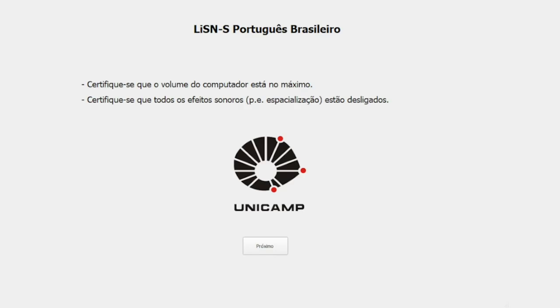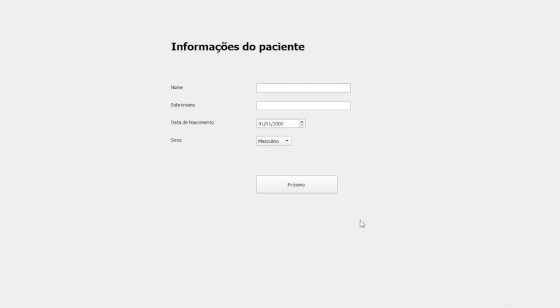Here is an example of how LiSN-S in Brazilian Portuguese works. It starts with an opening screen that reminds the operator to check if audio volume is set to maximum, and if all audio effects are turned off. By clicking Next, a tab opens for the operator to input patient's data, including name, surname, date of birth, and sex.